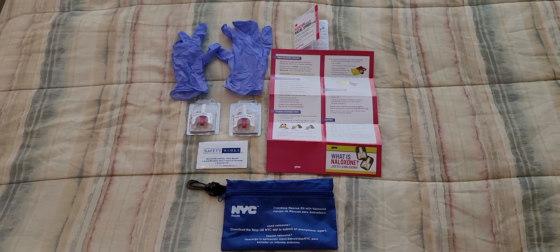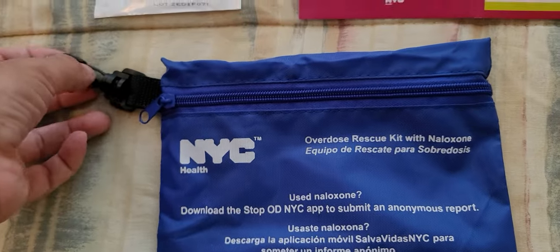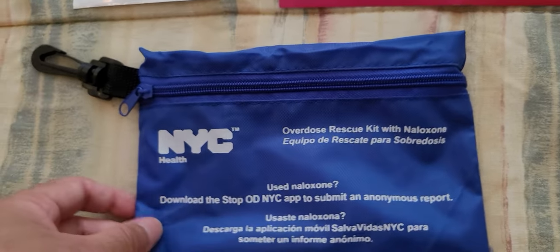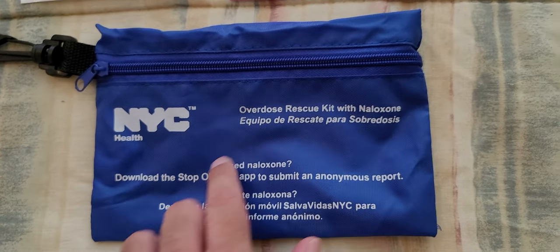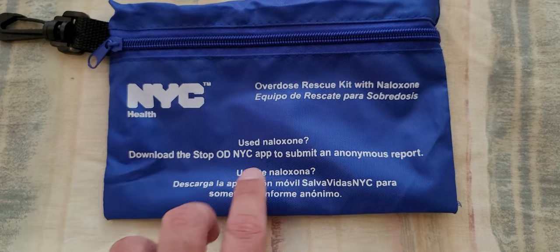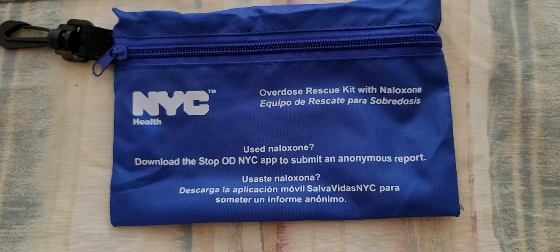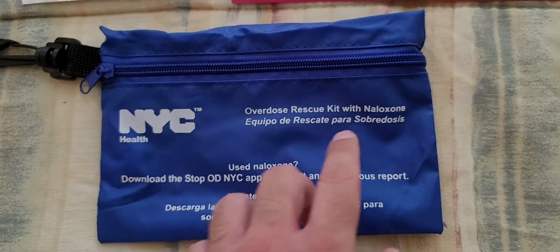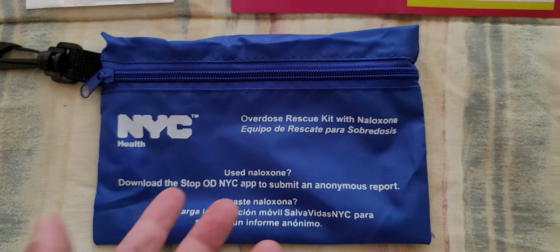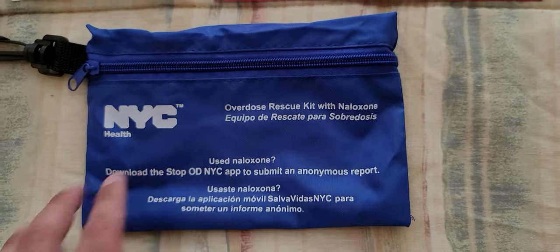The first thing you see here is this little bag — you can put this in your pants, on your belt, or around your waist. This is the New York City Health kit, and you can always download the Narcan app just in case you need help. This will rescue somebody that has opioids or is going through a narcotics overdose.